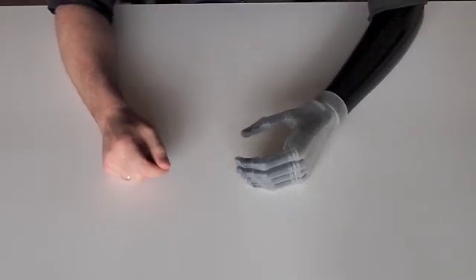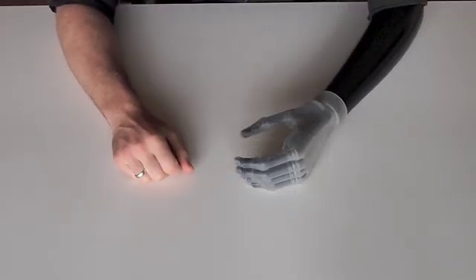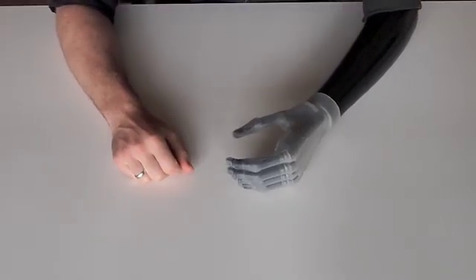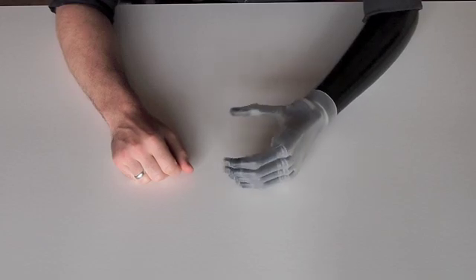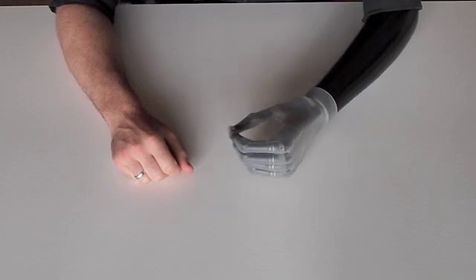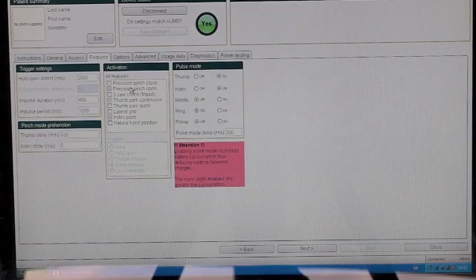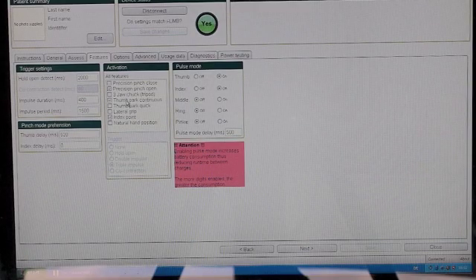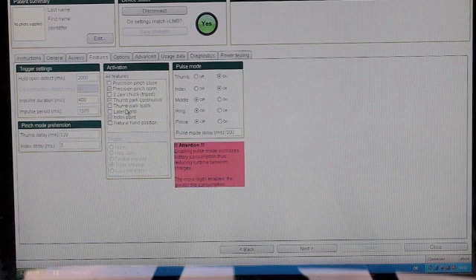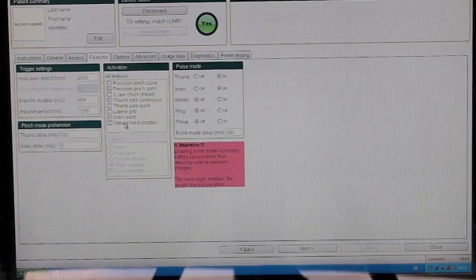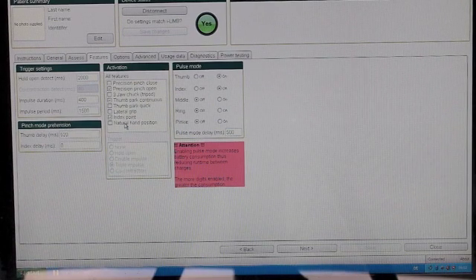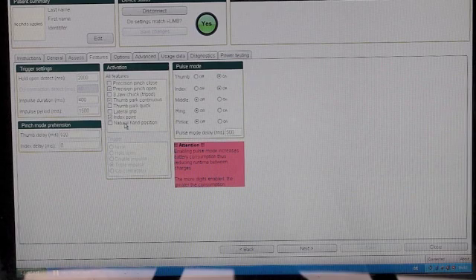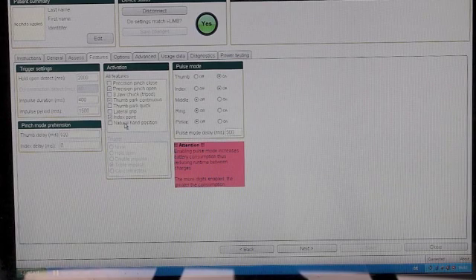This is the new iLimb Pulse prosthetic hand. I've been using it for about four months. You can tell the hand to switch to up to four out of eight available grip modes with included software. The software connects to the hand via Bluetooth.